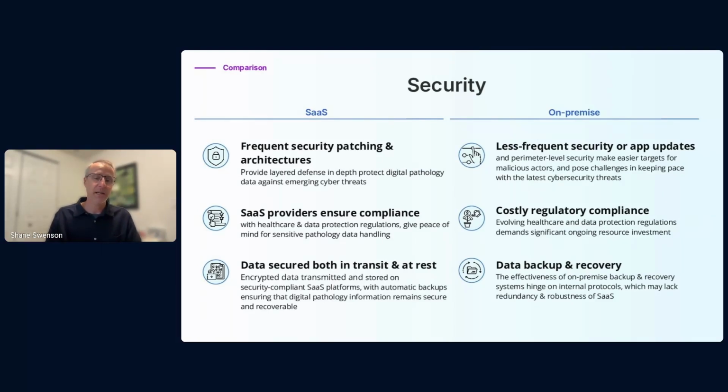It's going to create a multitude of backups of that data so that you have integrity and disaster recovery options. On the other hand, if you're running an on-premise solution, you're responsible for those backups, and you're responsible for assessing how to bring those backups off-site so that if you have a local emergency that compromises one location, like a physical problem with a data center, you still have the data that you're required to keep from a compliance standpoint.